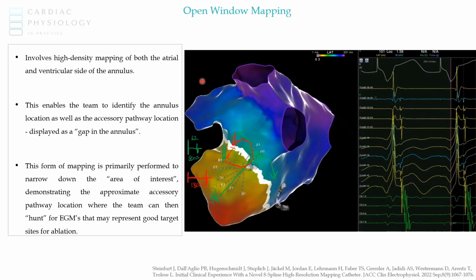It's more likely that this represents the mitral annulus, a fibrous ring of electrically inert tissue between this catheter location and this catheter location. And so we can take points all along the mitral annulus and define it this way. We can move our catheter here, then up here, then here, then up here.